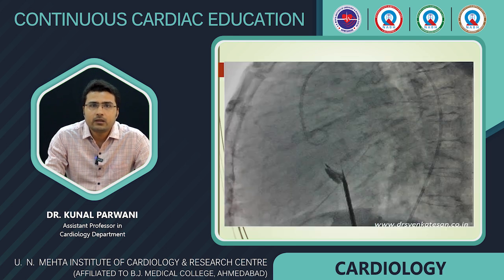The next step would be engaging the needle in the correct position and flushing the contrast to stain the septum. If the needle is snugly fitting the septum, we will not be able to flush the septum, but the septum gets stained. Staining the septum is of no major consequence, except that it can produce some ectopics rarely. Staining will give us the idea about the site of the puncture. A vertical stain indicates that we are parallel to the septum, and it usually indicates dissection. We require a more horizontal stain, and a horizontal stain is better.